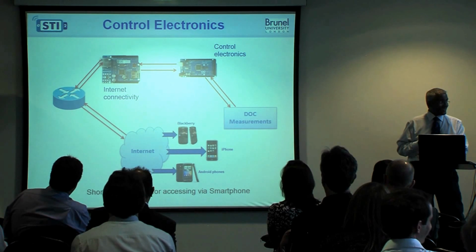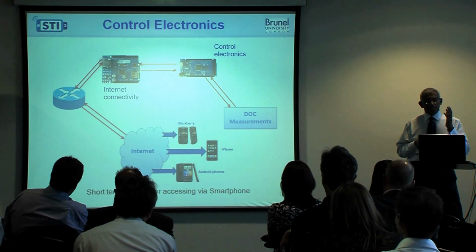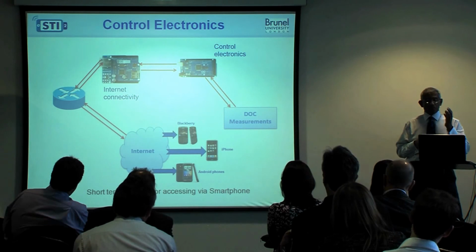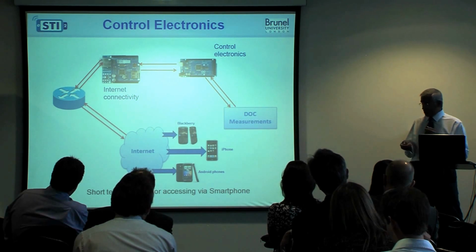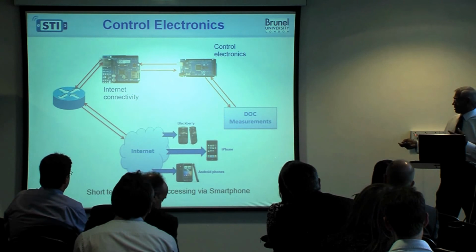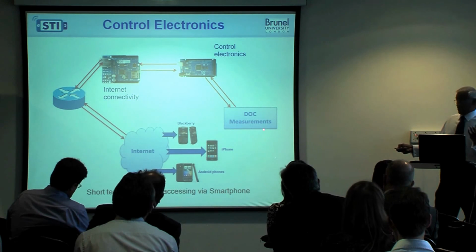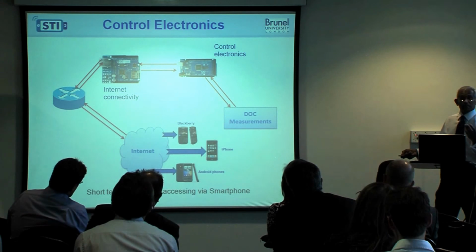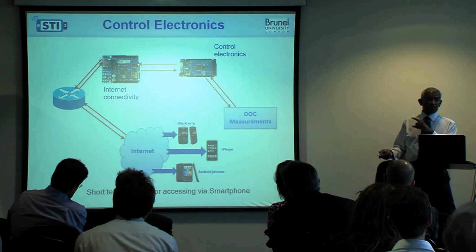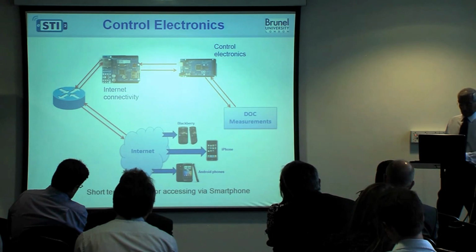Very quickly, just to indicate that it is very necessary these days for any of these devices to have wireless communication technology linked to it. So the concept is that you have a device, and we call it DOC, because when we started the project 10 years ago, we termed the project Doctor on a Chip. That's why it's called DOC. That's the device that we are developing. And then, of course, you have to use state-of-the-art wireless technology to communicate with the patient and also with the clinician who will eventually do the diagnosis. We are very keen that the device does not diagnose. The information needs to be sent to the clinician to do the diagnosis.